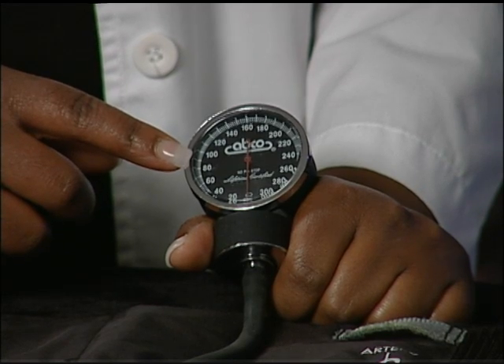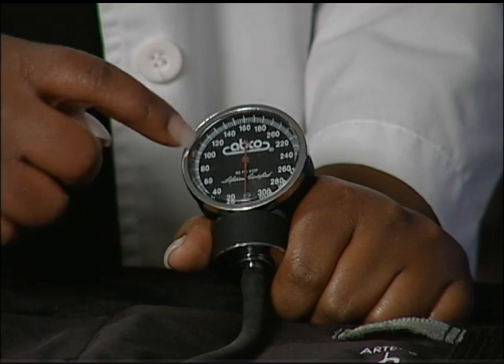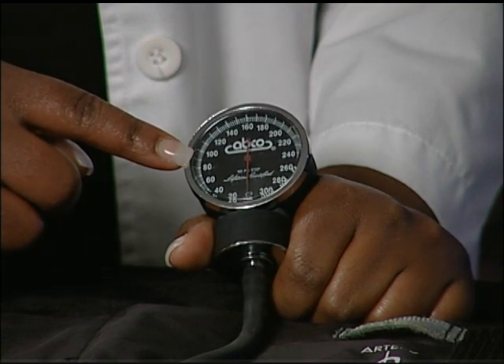The pressure gauge is also called a manometer. The needle points to the number to indicate the pressure in millimeters of mercury.